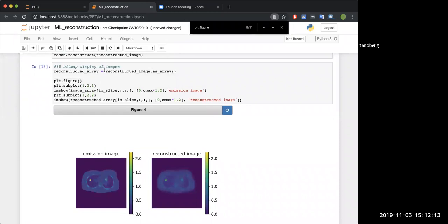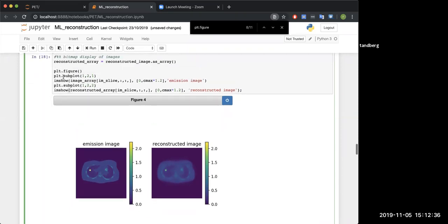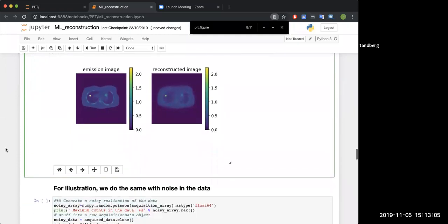We've used this a couple of times before. If I say as_array, we get it as a NumPy array. You can then plug it into any standard functions available in Python and NumPy. Do an imshow, and I've done a subplot to let me do things side by side. Here's the original image, and here's my reconstructed image. But this was all pretty easy because my sinogram that I tried to reconstruct was completely noiseless.